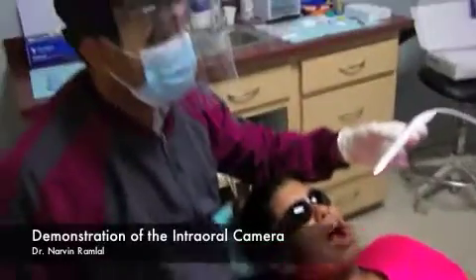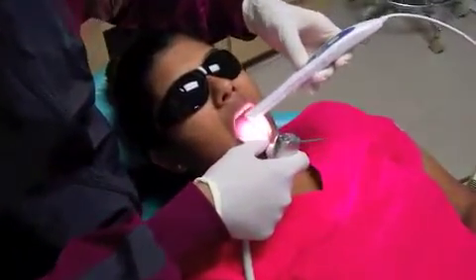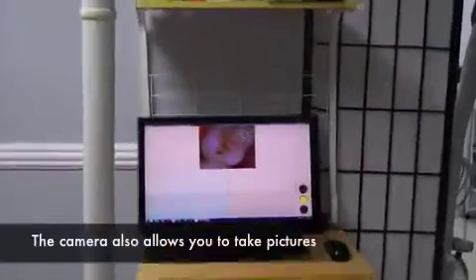Right? Alright, so this is the intraoral camera here, and as you can see, it's very comfortable for the patients, very easily inserted into the oral cavity. Open wide and nice, and you can get all the way to the back.